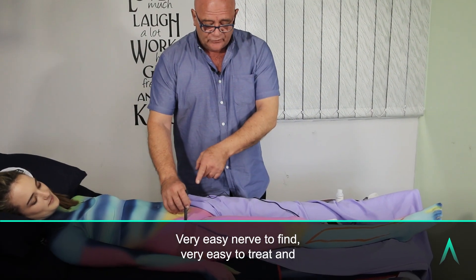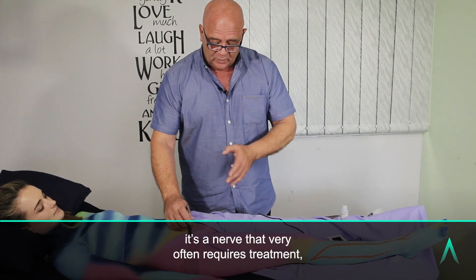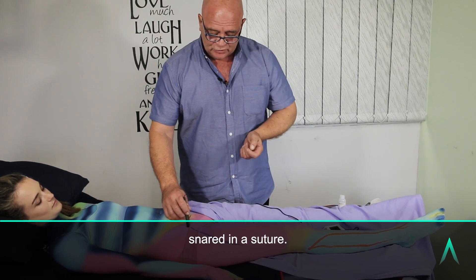Very easy nerve to find, very easy to treat, and it's a nerve that very often requires treatment because it's a nerve that gets impinged or snared in a suture.